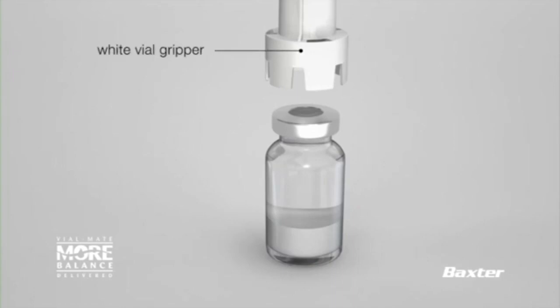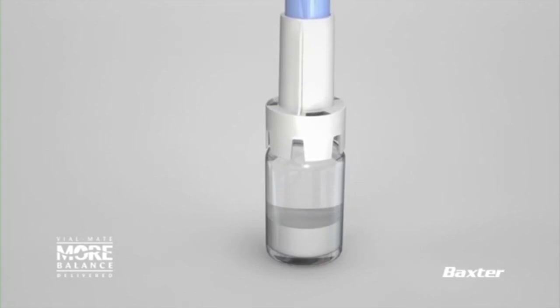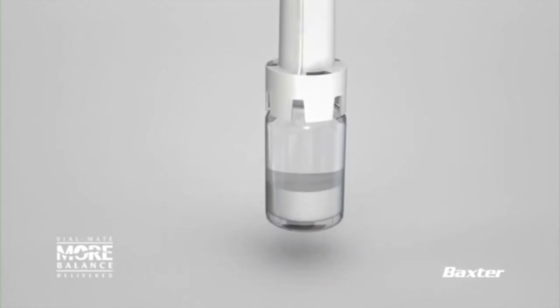To assemble the vial mate is super simple. Just press the white vial gripper down onto the vial. Now, this does take some force, so place the vial on a table and make sure you press straight down.